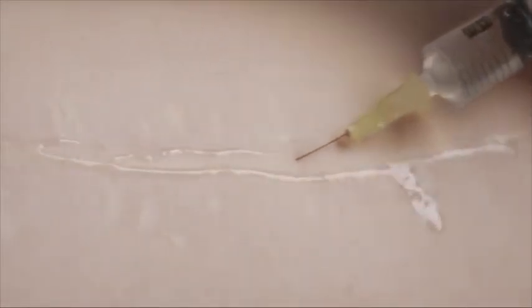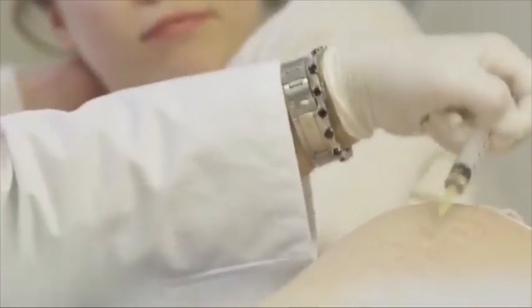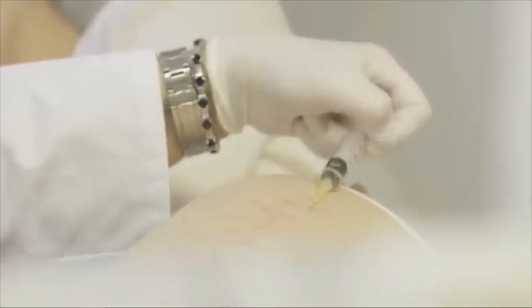How does the method work? First of all, a microsyringe glides softly along the skin surface. In a second application, the doctor penetrates the skin on a few selected points. The active solution we inject is able to improve the quality of the skin and the scar tissue, but also helps to prevent the development of hip arthrosis in this young patient. The principle of mesotherapy is the same for all kinds of application.